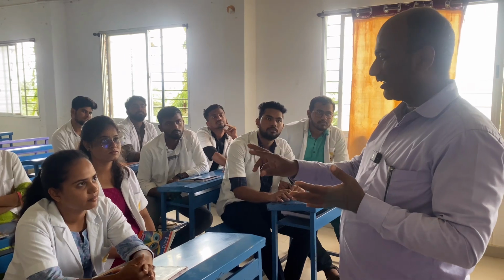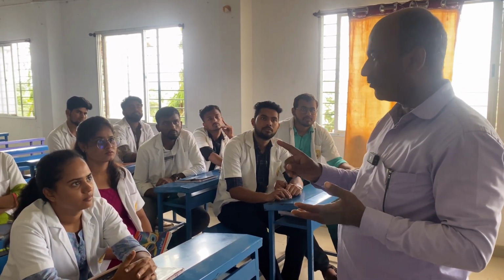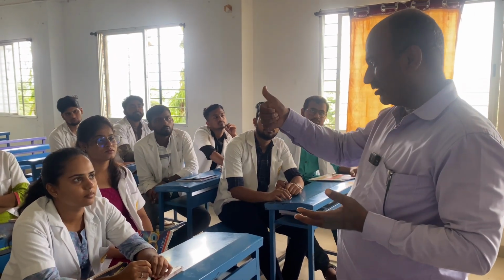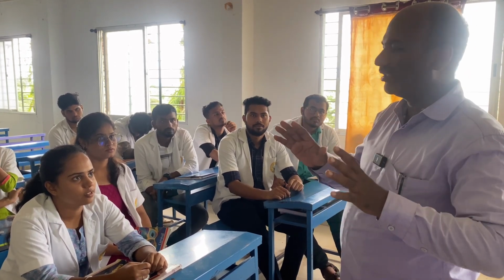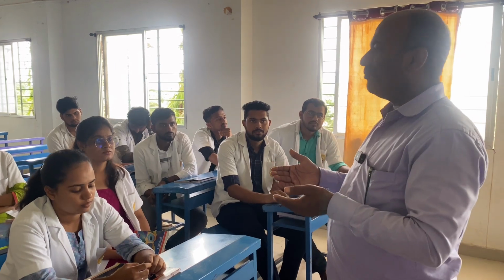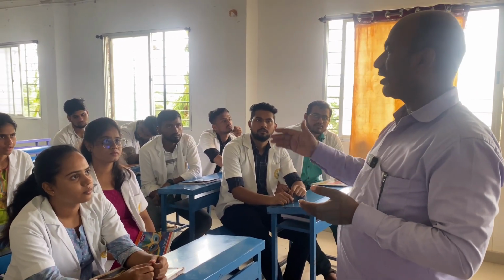The second one is the quality of vision. Quality of vision is directly proportional to the direct distance glow. From whatever glow you see, you understand that you have good vision or you have poor vision. If you have media opacities, meaning opacities in the refractive media.